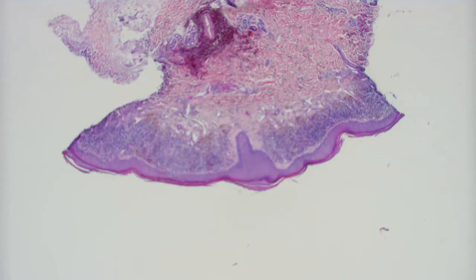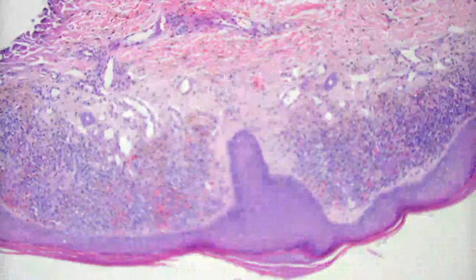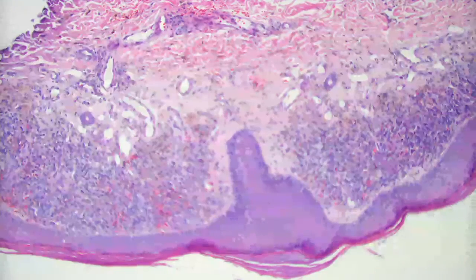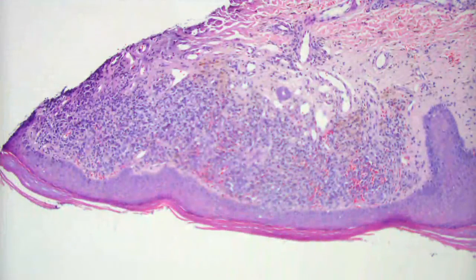I went through a lot of thoughts. You said because you thought it was lower extremity, but why? I interrupted you. Why did you think it was lower extremity? So there are a lot of blood vessels. Good. And many, excellent. And they're very thick walled too, aren't they? Some of them look thick walled, some of them look a little bit more irregular, but yeah. So that's kind of like stasis altered skin. They probably don't have stasis dermatitis, but they've got stasis altered blood vessels. So that's excellent that you're able to recognize that.